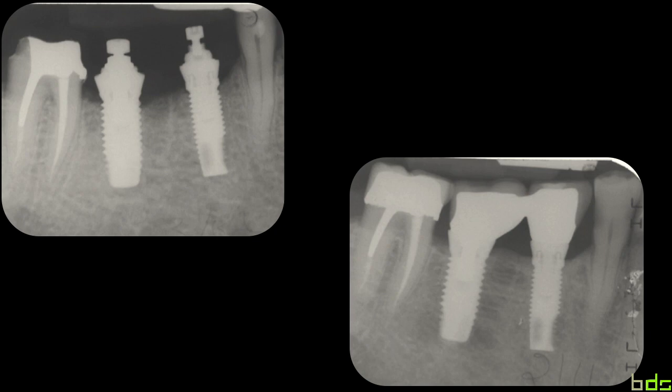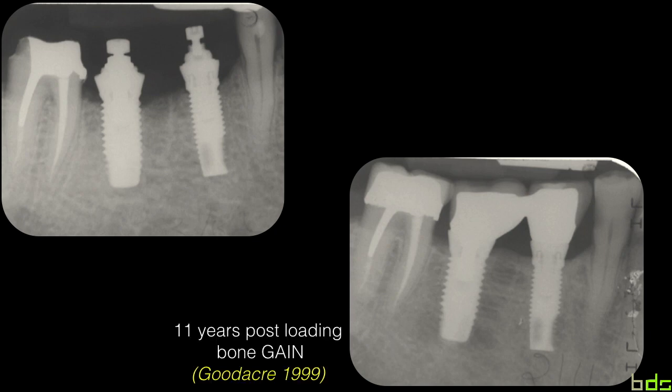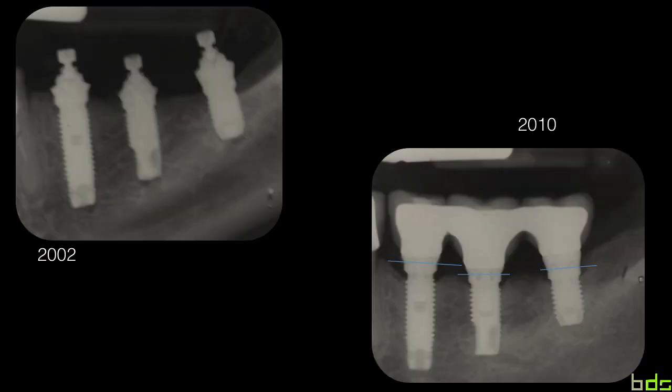Here again, in some cases, we see bone gain 11 years post-loading, in a phenomenon described by Goodacre in 1999. Same here, 2002, 2010, 8 years, very, very stable bone. Now you still have this dieback till the first thread, and then a very stable result throughout time. Now this dieback, how clinically relevant is that? Do we observe any kind of difference on the clinical level?